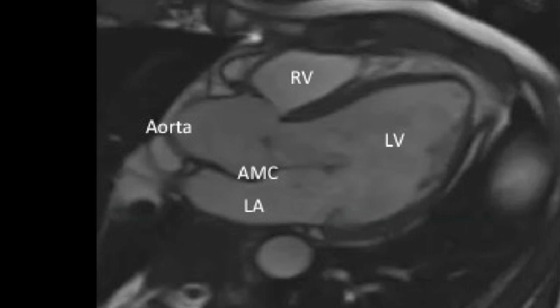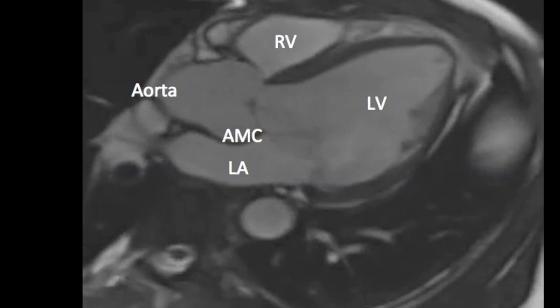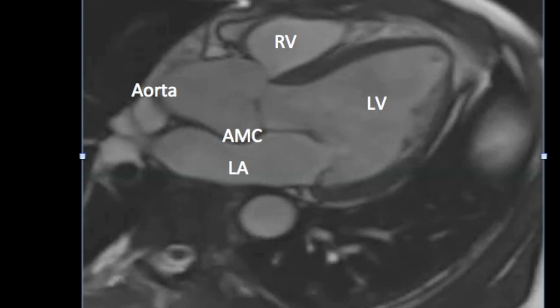On the three-chamber view we can also look at a portion of the right ventricle. Now the pathology seen on this three-chamber view is aortic regurgitation with a regurgitant jet hitting on the anterior leaflet of the mitral valve. That's the answer to the second question.